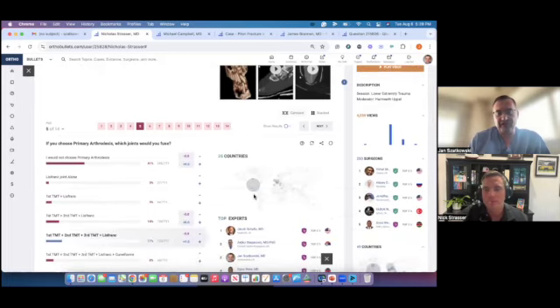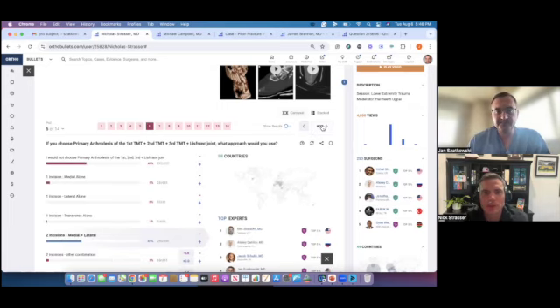Right. And I'm with you on that. I would do first, second, third. And I tend to leave the fourth and fifth unless they're dislocated, in which case I open reduce them. And if I need to open reduce it, I'll put a screw across it. That's temporary, almost like planned hardware removal for the fourth or the fifth. I don't want to always pin it because I think pins can move and I don't think it's as rigid. So I just plan a hardware removal to take out whether I reduce it with a cannulated or a solid screw, and just take that screw out in a couple of months. I think that's a good idea, just having something to give you a little bit more stability there.